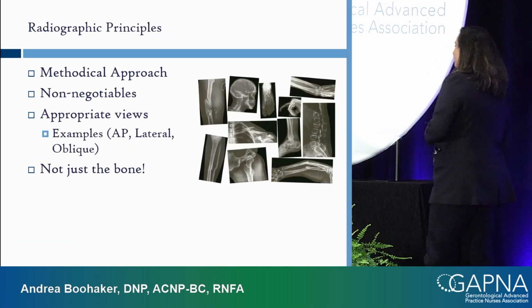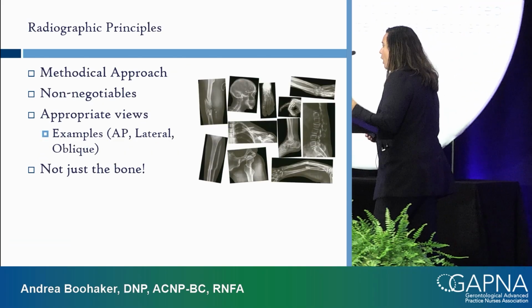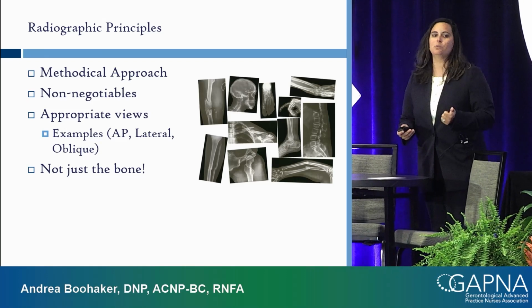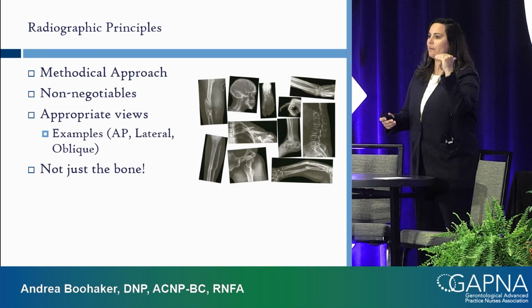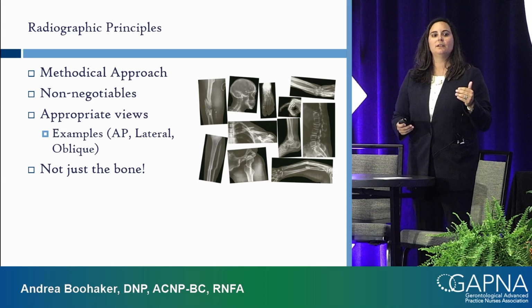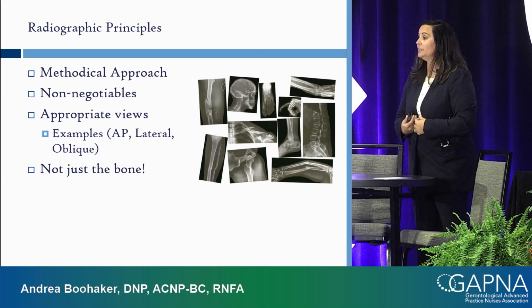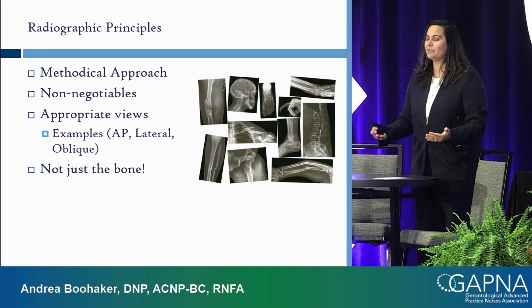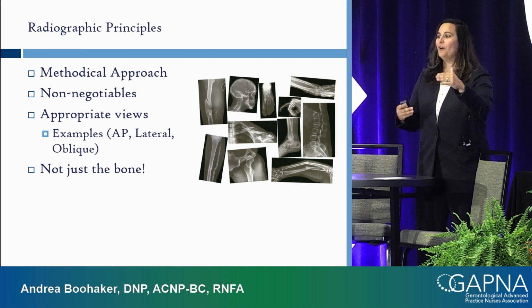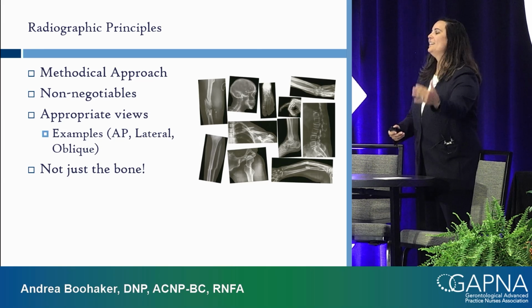Okay, radiographic principles. You always, always, always want to have a methodical approach. If you go through something the same way each time, you won't miss anything. I'm sure you tell your kids that. At least I do. You wake up in the morning and you brush your teeth. It's very simple. But somehow they seem to forget that because they don't follow the algorithm, okay?